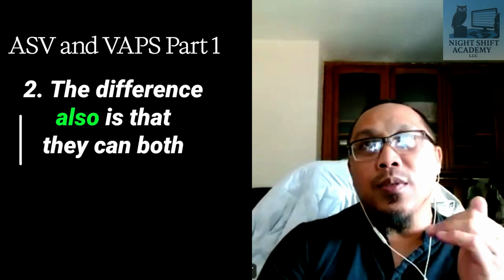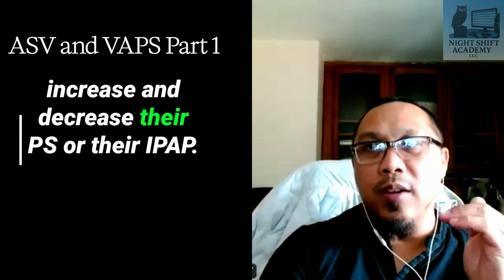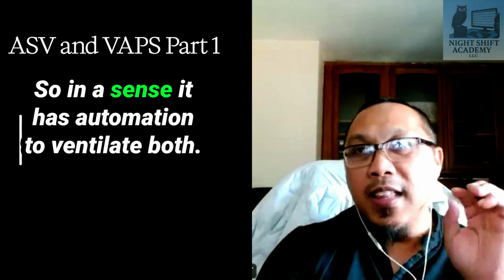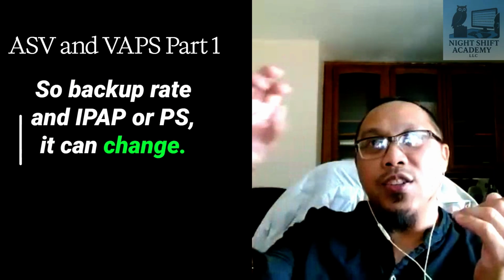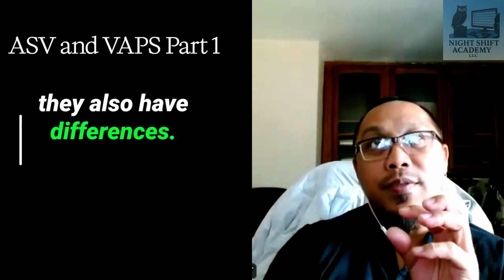They can also both increase and decrease their pressure support or their IPAP. So in a sense, it has automation to ventilate both types of patients, in ASV and in VAPS. So backup rate and then IPAP or pressure support, it can change, it can vary. So that's why they have similarities, but they also have differences.